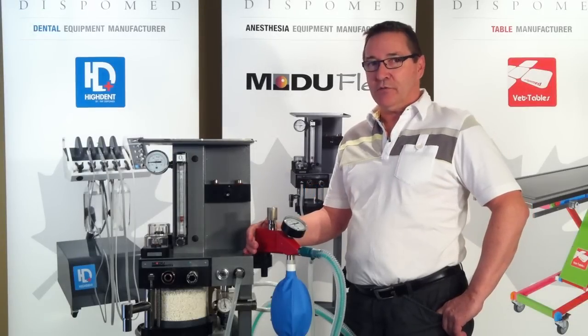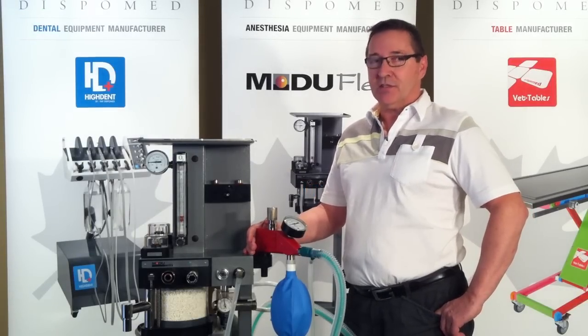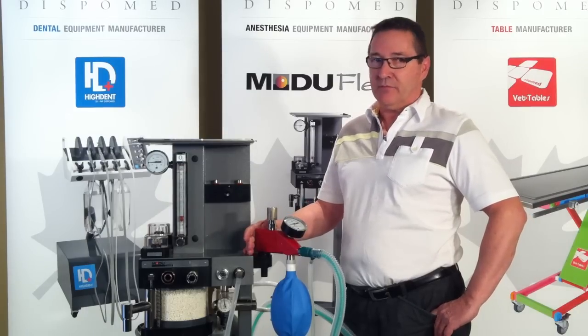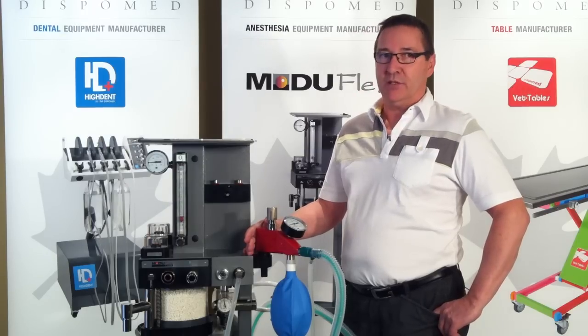Today we'll talk about the Moduflex Bain circuit adapter: its advantages, its operations, its use, the fact that it can be mounted on any type of anesthesia machine, and why we should use a Bain circuit adapter.